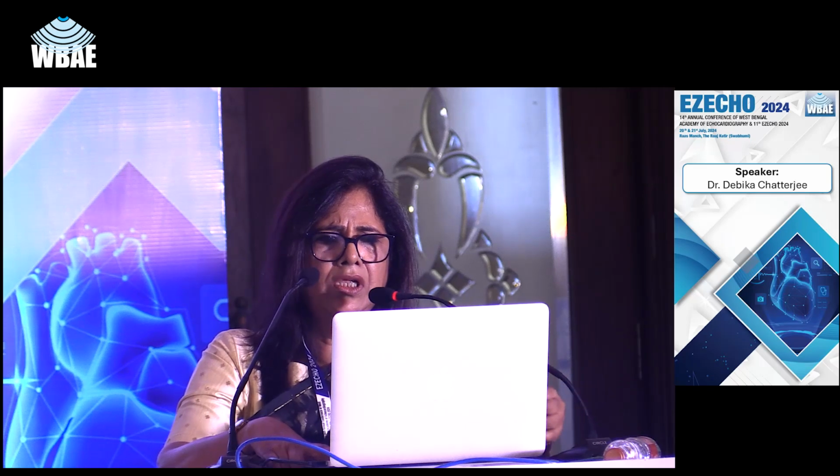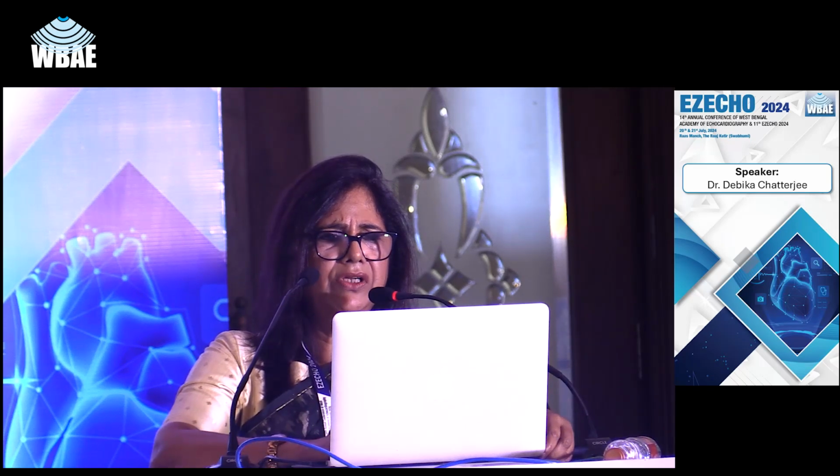Now, what is this E by E prime? Everyone knows it is a ratio, the ratio of transmitral E velocity to the E prime. As per the latest guidelines, if the average ratio is 14 or more, it indicates raised LV filling pressure.